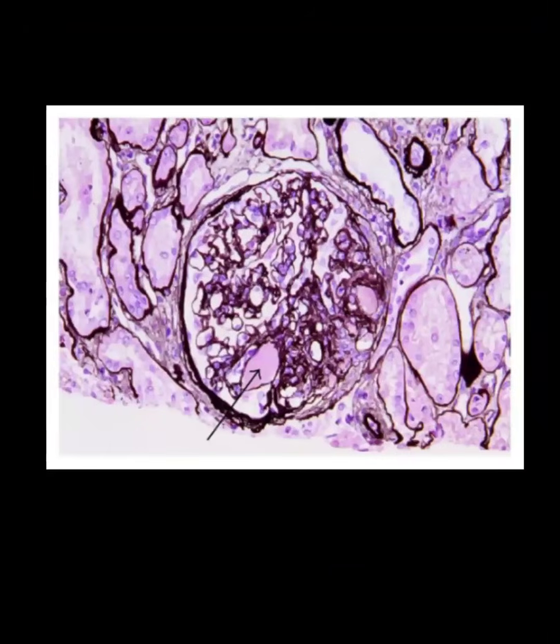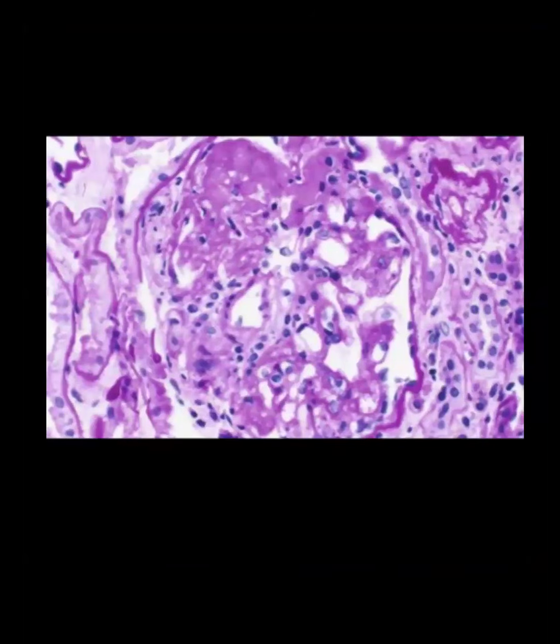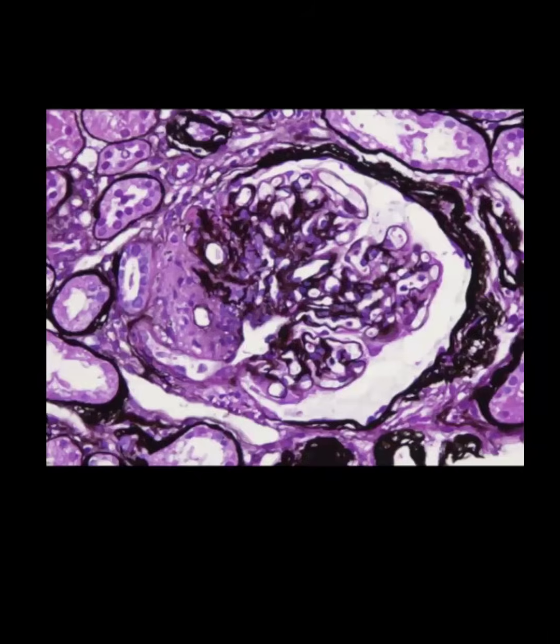Again, can you tell me what is the diagnosis here? This is also FSGS. You can see the tuft glomerular capillaries are usually at one pole. This is damaged, okay? There is a sclerosis at one pole, so it is FSGS. What is the diagnosis again here? Segmental sclerosis. Very good. So there are different pictures of FSGS. Thank you very much.